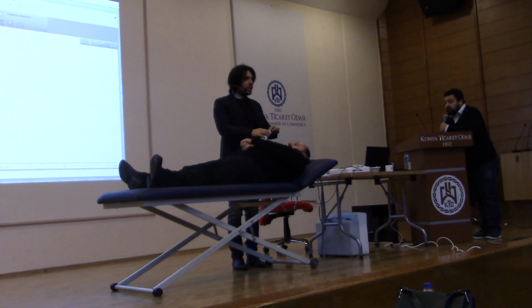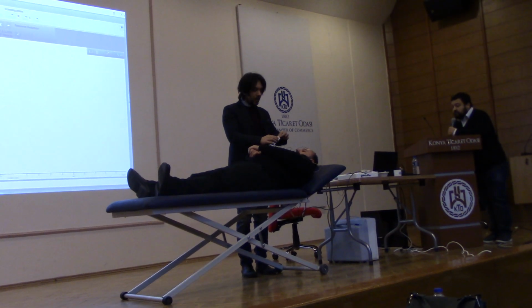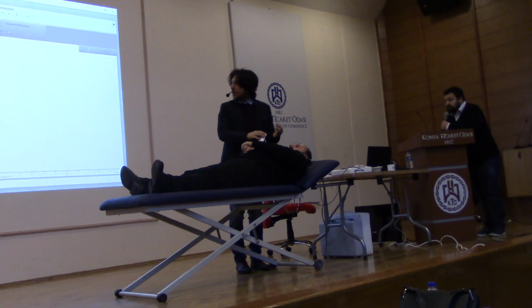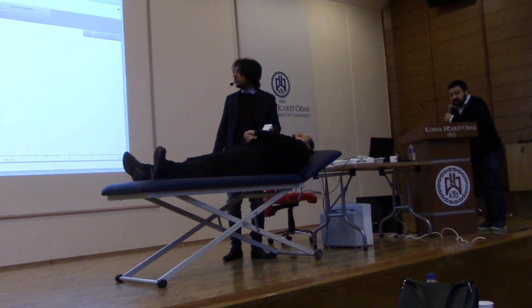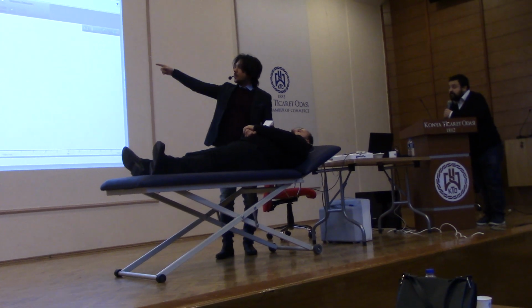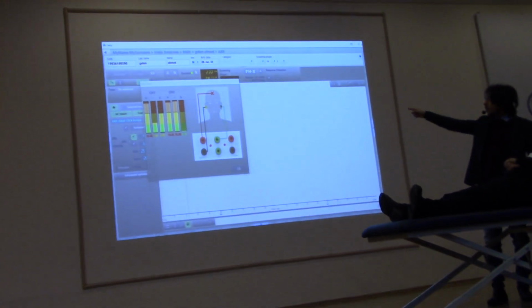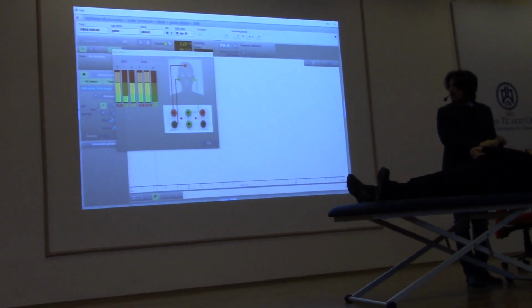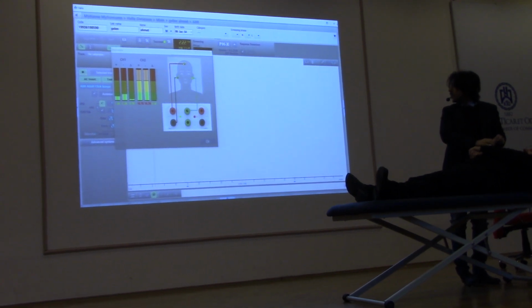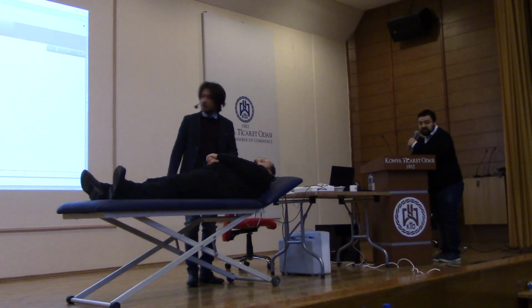Supposing that one electrode is broken or impedance is not sufficient, I unlink. Bir elektrot kırıksa ya da impedans yeterli değilse, you see that the positive rises up and it indicates pozitif elektrodun nasıl arttığını gösterdi. Pozitif arttığı gibi diğer elektrot impedanslarında da artış oluyor. İnter elektrot, yani elektrotlar arasında impedans değişiyor bu sefer.